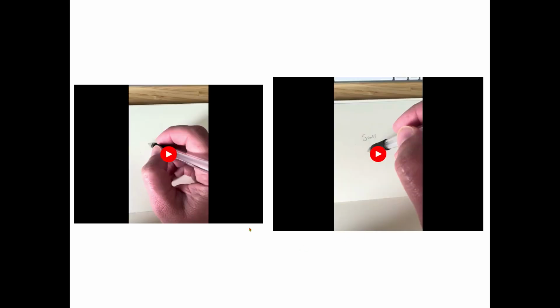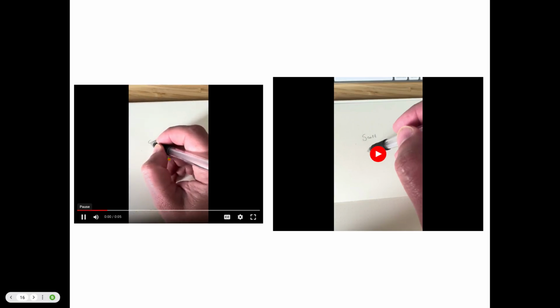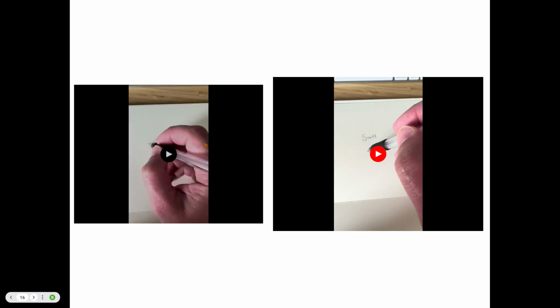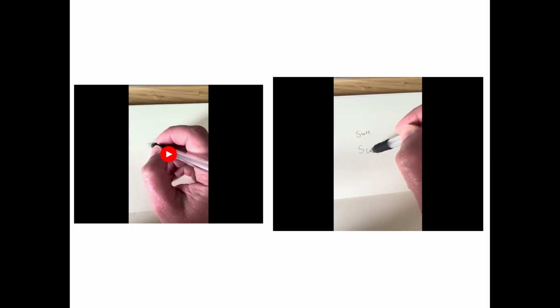We want to hold the probe close to the end, and the better control you're going to have, just like writing with a pen. You're not going to grab a pen from the back of it. You will look crazy. So try to hold the probe as close to the skin as possible. And I would recommend even anchoring your hand on the patient's body when you're scanning, if it wouldn't be unreasonable to do that, or at least dropping your pinky down to anchor your hand so you're not sliding all over the place while your eyes are fixed on the screen.